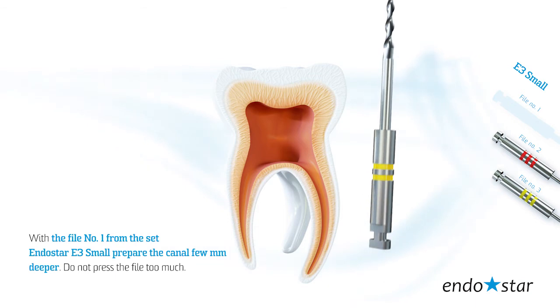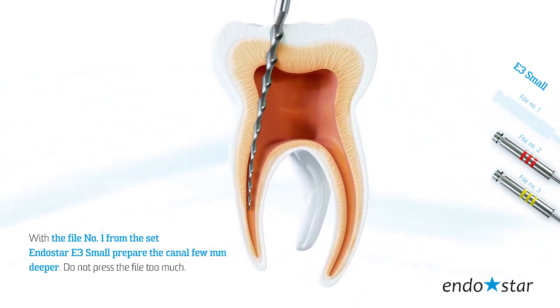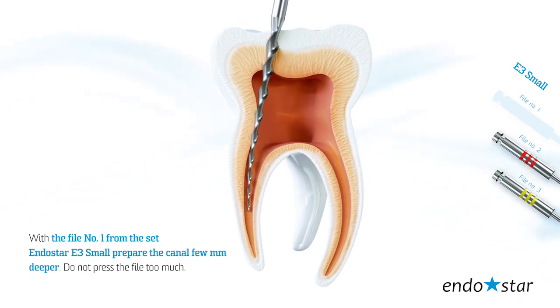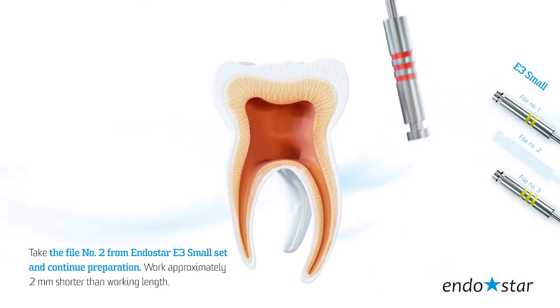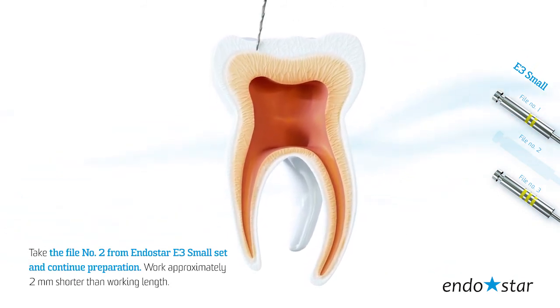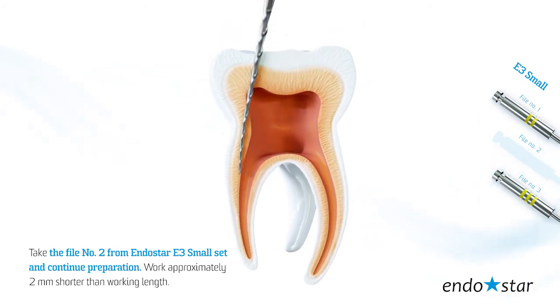With file number 1 from the Endostar E3 Small set, prepare the canal a few millimeters deeper. Do not press the file too much. Take file number 2 from the Endostar E3 Small set and continue preparation, working approximately 2 millimeters shorter than working length.